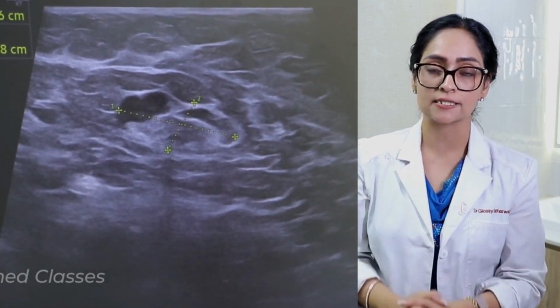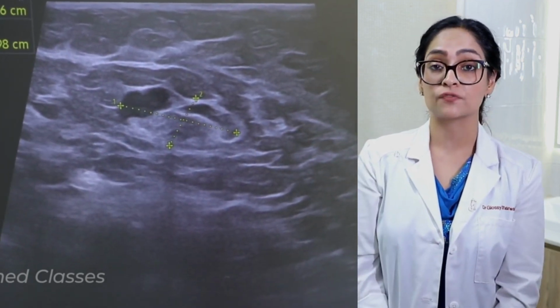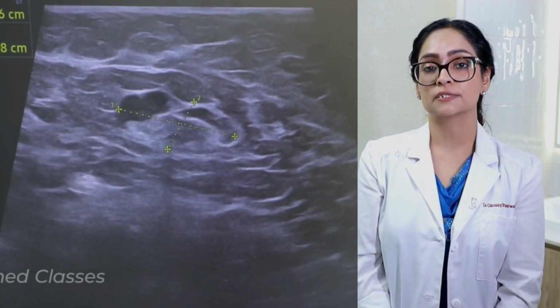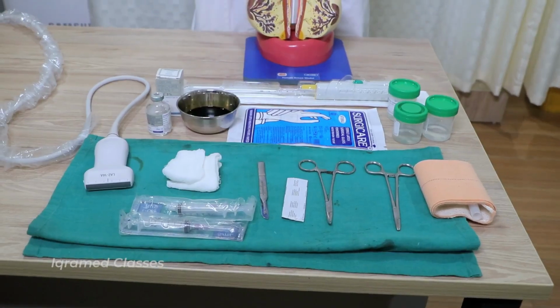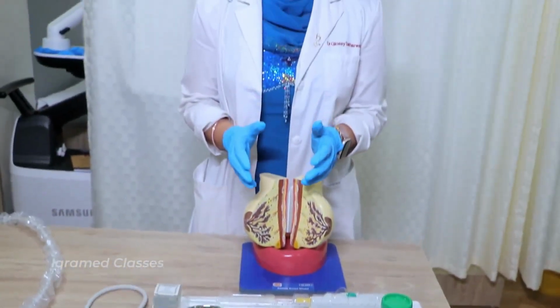So that is how the case is diagnosed as a BI-RADS 5. We will talk about the BI-RADS reporting on ultrasound in our next lecture. If you want to start doing breast interventions at your clinic, what all do you need?